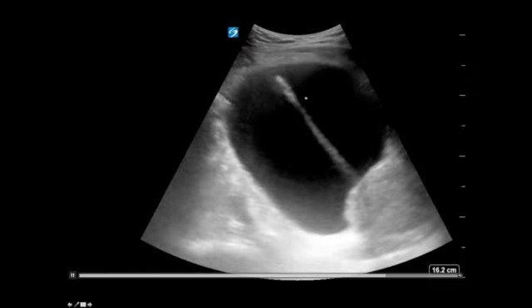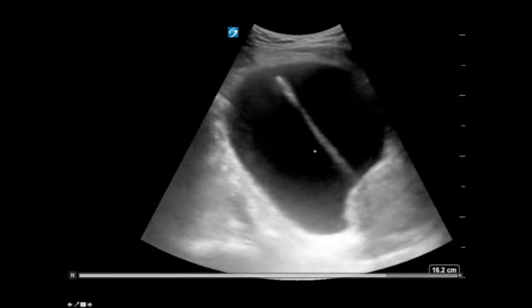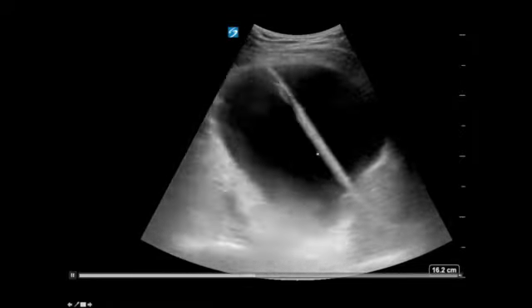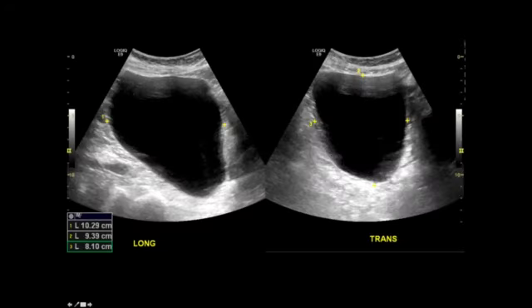So very useful as you see the catheter pass, and then you know that you're actually in, and it's safe to blow up the balloon. So certainly in those very difficult catheters, I often watch to confirm that the catheter is passing. And sometimes ultrasound's amazingly useful, like this patient who has what looks like a bladder, and a big bladder at that as well. Catheter was passed, but no urine came out, and caused a whole lot of concern.